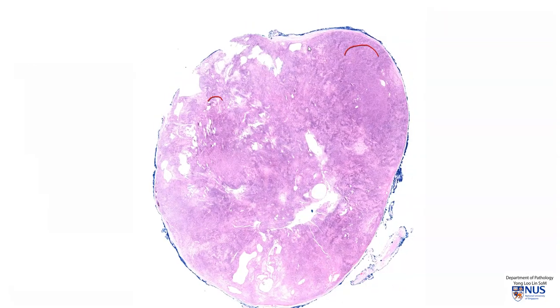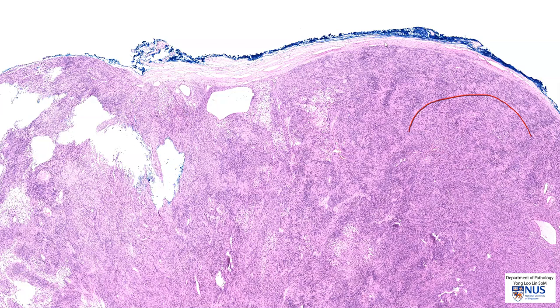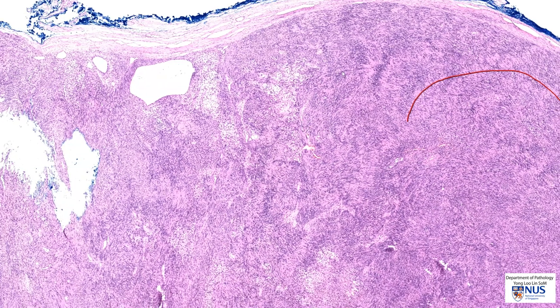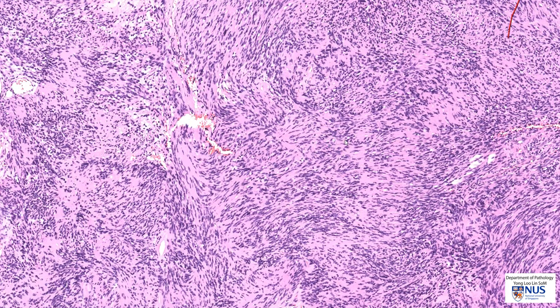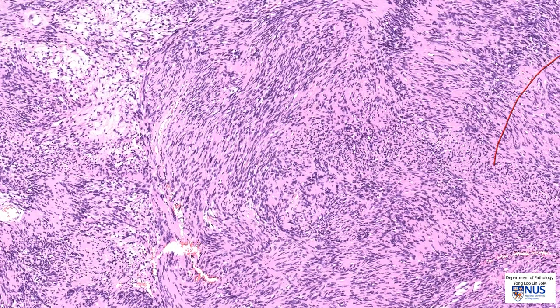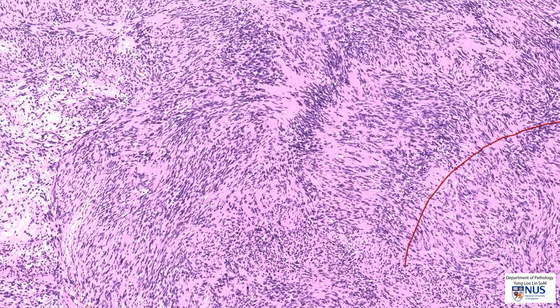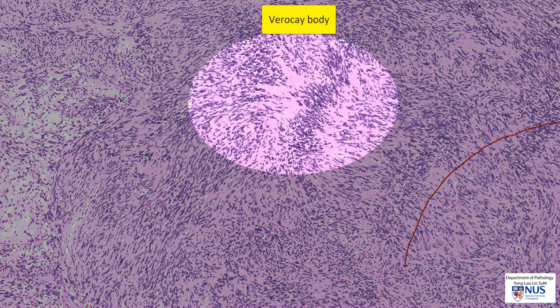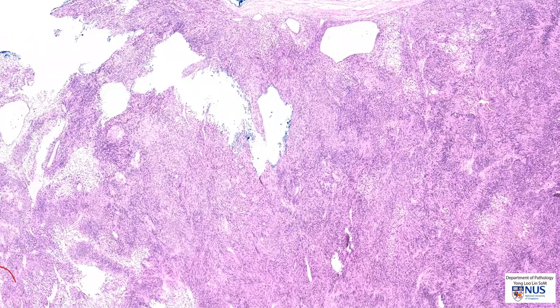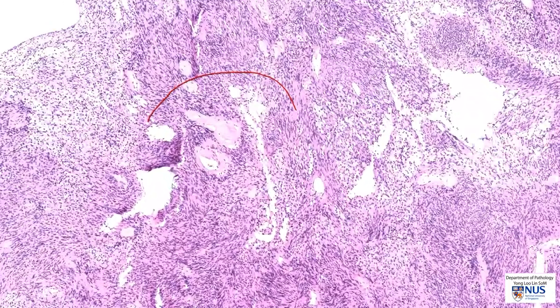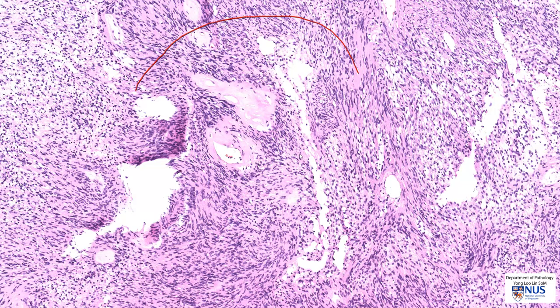In summary, this is a schwannoma — an encapsulated tumor composed of biphasic areas of more cellular Antoni A areas and less cellular Antoni B areas. The cells have spindled slender nuclei with ill-defined cytoplasm, and we can see very prominent nuclear palisading. This is a Verocay body with a double nuclear palisade and intervening fibrillary eosinophilic areas. This tumor also demonstrates hyalinized blood vessels. This is a benign tumor, and excision is curative. Thank you.